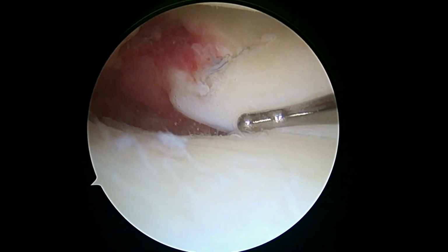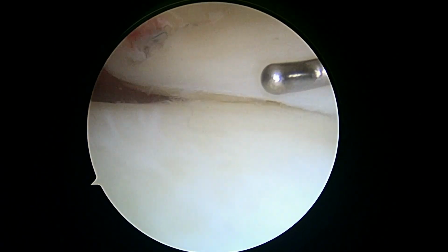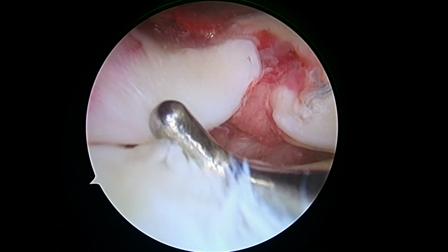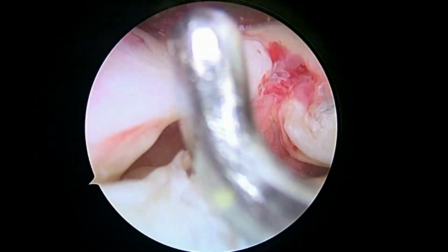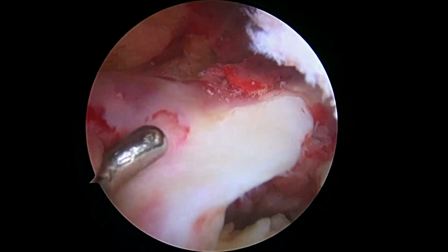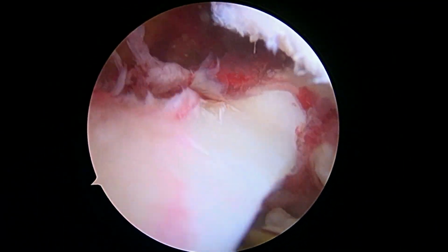Okay, so we've got one implant in, and that's holding things down pretty good. Here's how the meniscus looks over here. We've still got this split, and I don't know if I stretch it, we might be able to get a suture to close down the hoop, if that makes sense. We'll have a look at that.